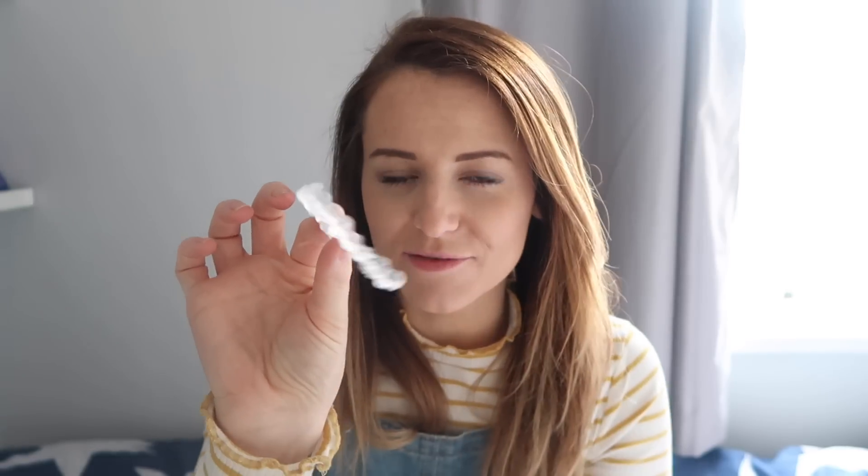They are on my teeth right now. So if you've never heard of Invisalign before, they are a clear brace that looks a little bit like this. It's a clear plastic brace that is moulded exactly to your teeth, and every week you change to a new brace that's in a slightly different position, so it's eventually going to move your teeth into the position that you'd like them in.